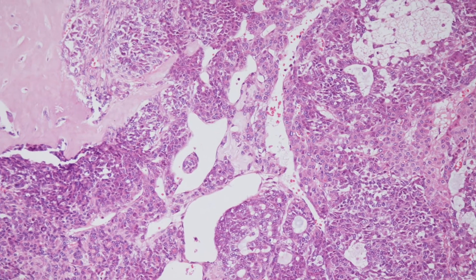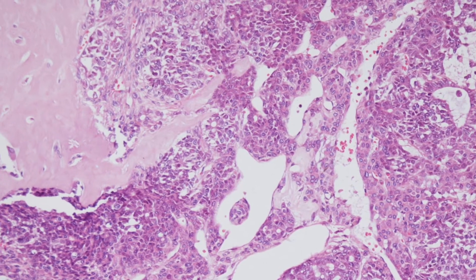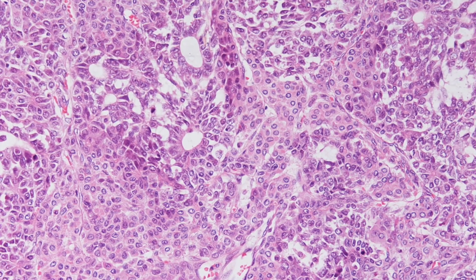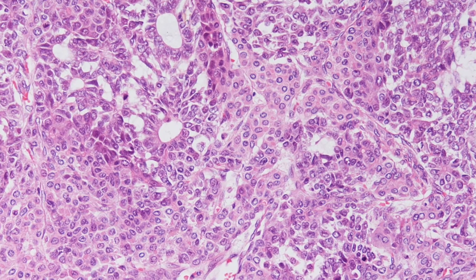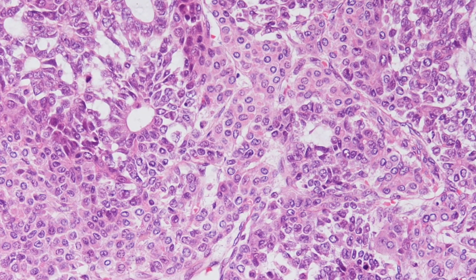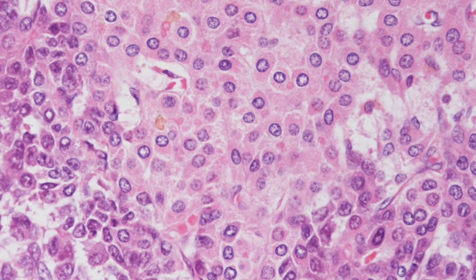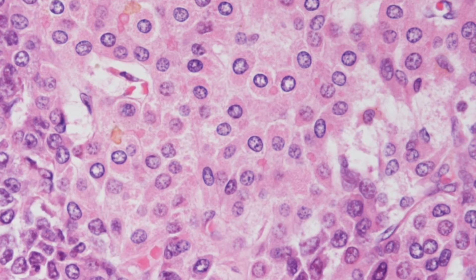A slightly higher power and we are zooming into this pink stuff. What is it? Here is a higher power of the cellular areas. Here is another area, and the appearance of these cells that we are zooming into should give a clue to the diagnosis.